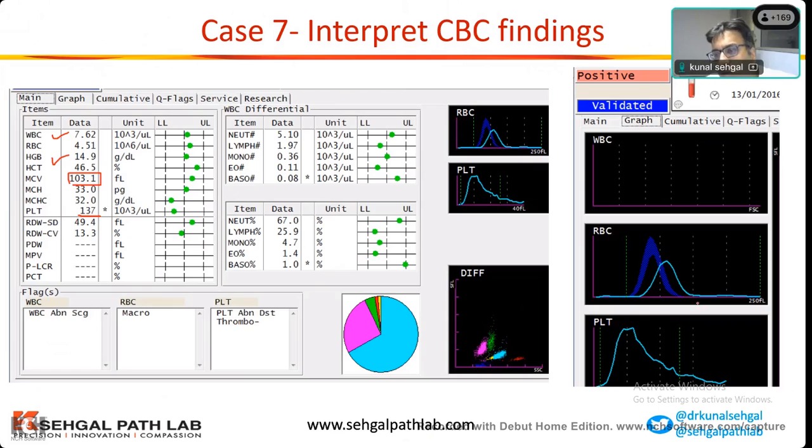So drug therapy, as you said, thyroid, liver function test, we need to know all that. This patient was on hydroxyurea therapy and had slight macrocytosis. If I remember correctly, this was the same patient and had borderline thrombocytopenia. So this was a drug causing macrocytosis.